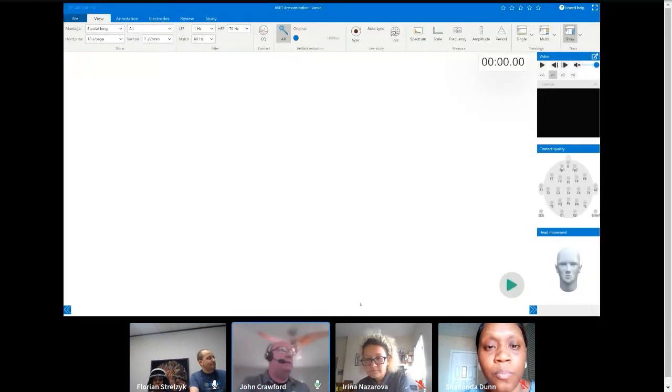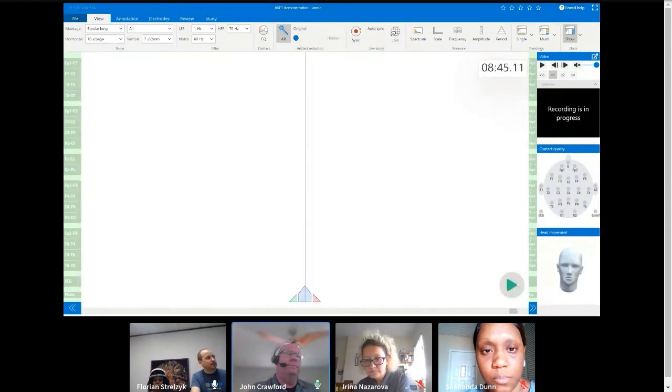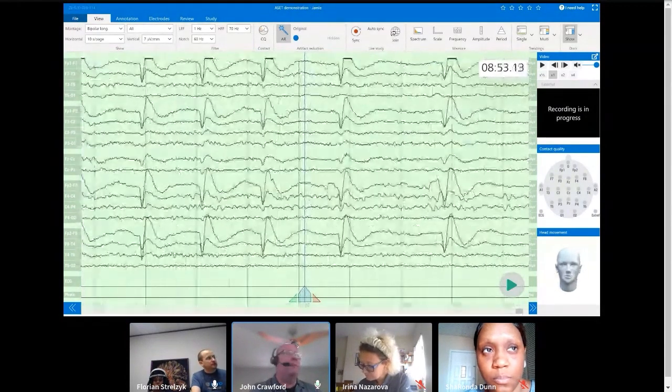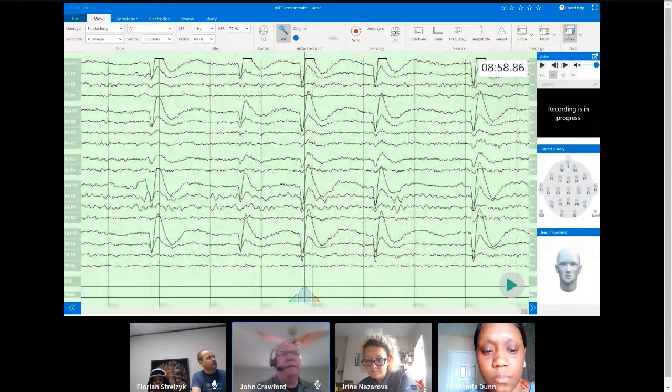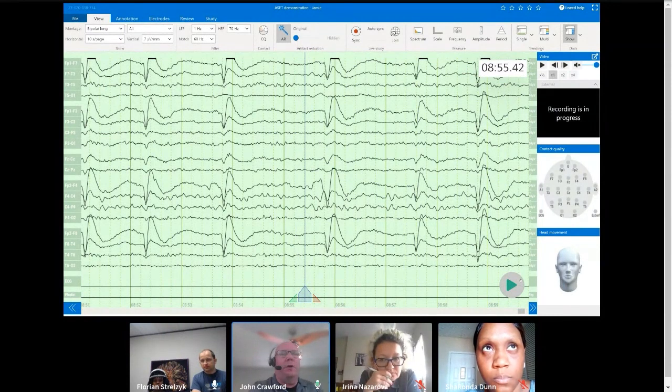So with traditional EEG during a GTC, you have movement, you have twitching of extremities, maybe jerking of the head, even banging back against the bed. With traditional EEG electrodes, maybe you'll see the onset of the seizure, and then once they actually get into the GTC part of it, you end up with artifacts. With us, you would get the exact same thing. When that headset is banging back against the bed or moving onto the side, that is where you're going to get those artifacts, just like you would with traditional EEG. There's just no way around that.